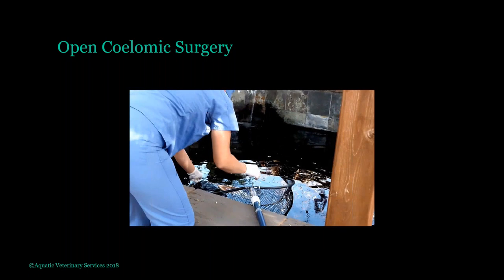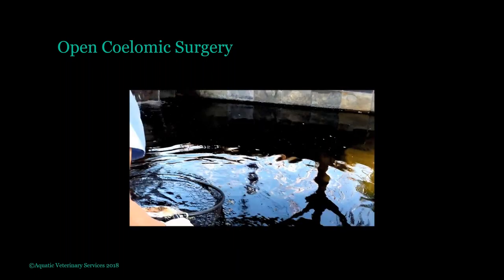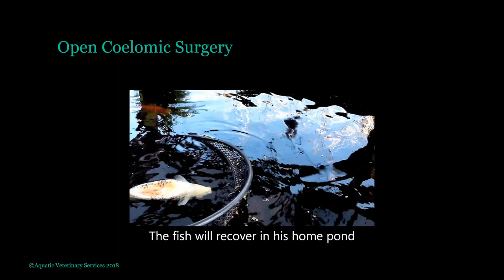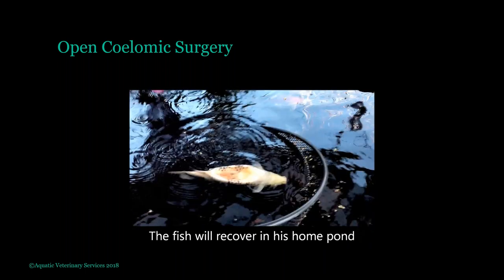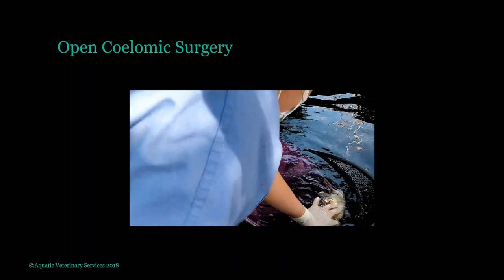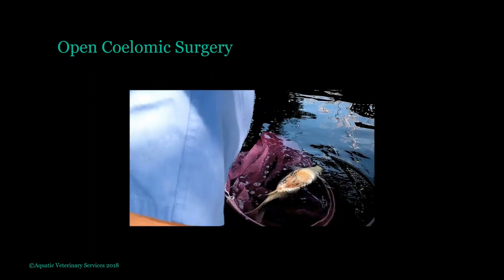Oh, so he'll stay confined to the net for a while? Until he wakes back up. Okay. Will he turn himself over? I actually have to take some air out of him first. I'm just going to put this one for extra protection. I don't have to give him multiple shots. Right.